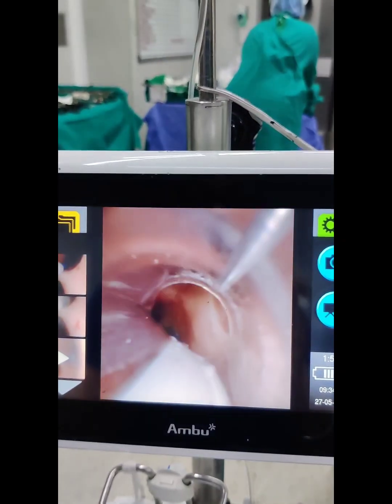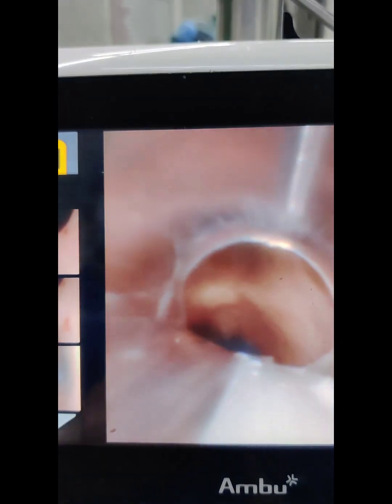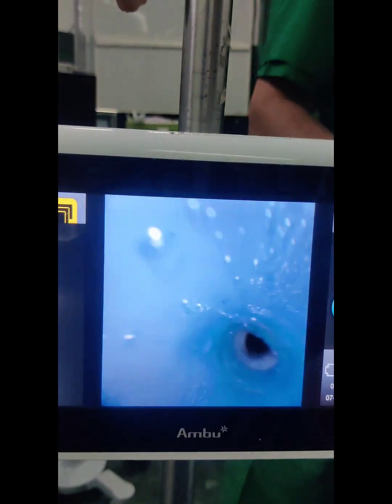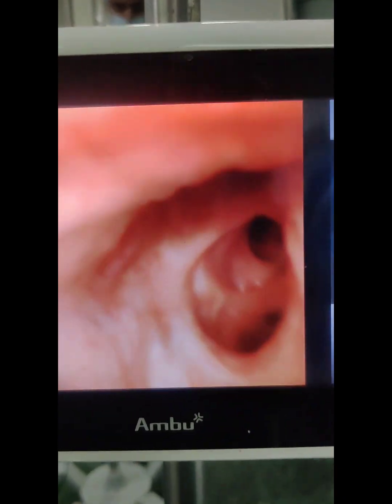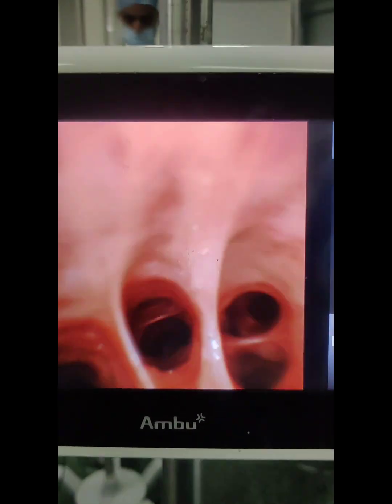Once confirmed, the fibre optic bronchoscope is withdrawn from the tracheal lumen and the self-sealing adapter cap is closed. The bronchoscope is then introduced into the bronchial side of the adapter. In a left-sided DLT, advancing through the bronchial lumen allows identification of the origins of the left upper and lower bronchus, ensuring the openings are not occluded. In a right DLT, confirm good alignment between the slot opening in the bronchial cuff and the opening of the right upper lobe bronchus.